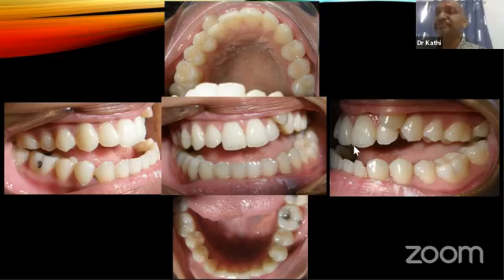Okay, this patient also had a crossbite like this, but certain crossbites can be camouflaged. And this one was camouflaged, and she had a final result like this. So a small amount of camouflage is possible. This patient also, if we see this part here, it is slightly bigger compared to this part. Some part can be due to soft tissue also. Okay, but intraorally, she did have a crossbite here. This part is biting more buccally, and gets more buccal the more posterior it goes. So we are trying to camouflage this.